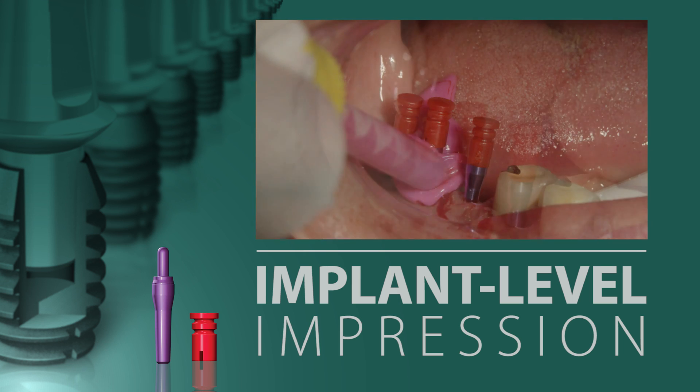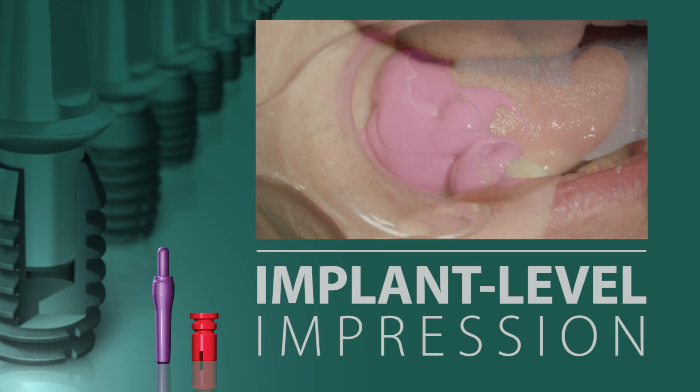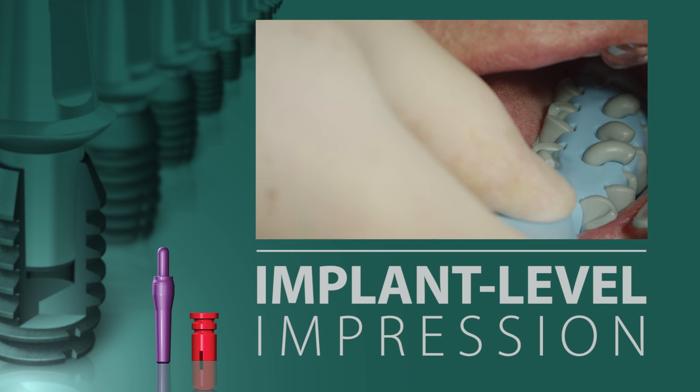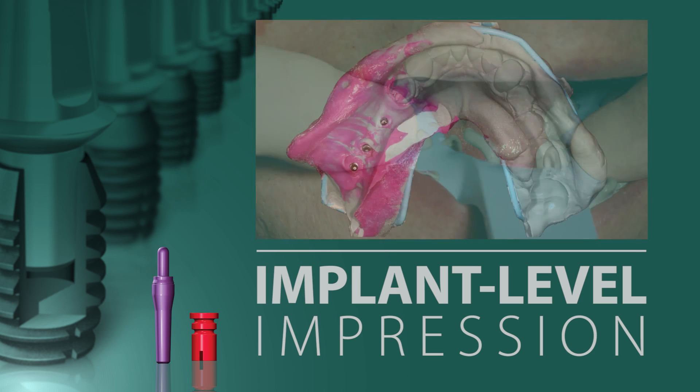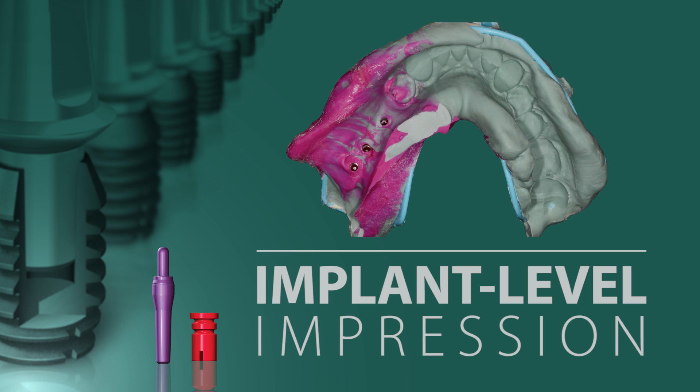A light-bodied impression material is injected over the impression posts and sleeves and the impression is made. It is paramount that the impression posts stay in the well of the implant and only the sleeves are captured in the impression material. If a post were to come out during the making of the impression, you must remake the impression, for you may not have accurately recorded the axial position of the implant.